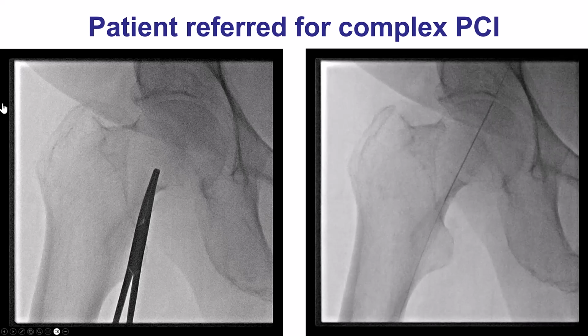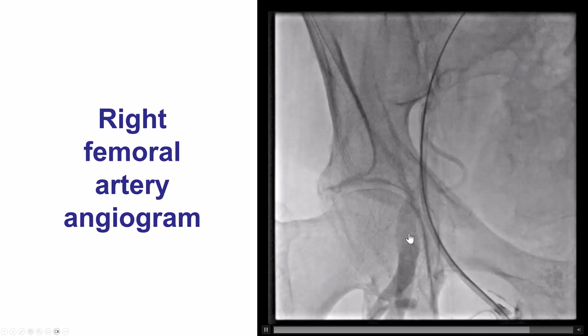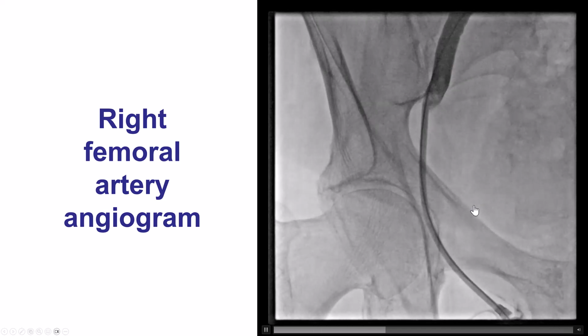We did choose femoral access because of the complexity of the procedure, and we obtained access using standard techniques, including fluoroscopic guidance with forceps, as well as ultrasound guidance and a micropuncture needle kit, with a slightly high entry point at the top of the femoral head. However, the angiogram done after obtaining access shows a good access point. The access is below the inferior epigastric artery.